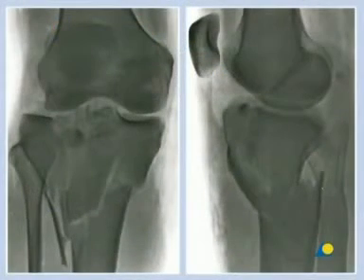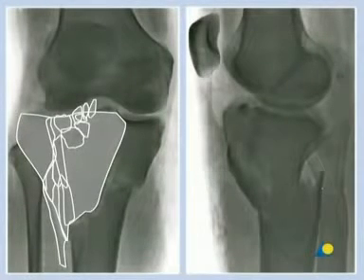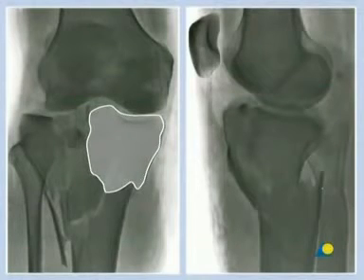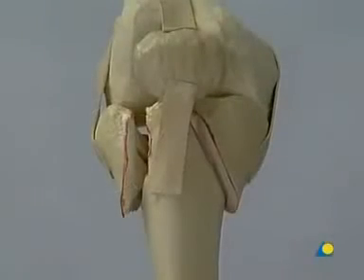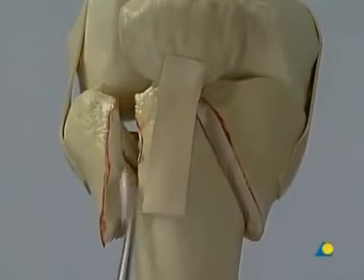Bicondylar type C fractures of the tibial plateau are multifragmentary articular fractures, characterized by the involvement of both the medial and lateral plateaus. As a rule, on the lateral side there is usually considerable comminution and impaction of the articular surface. On the medial side, there is usually a large bone block that has been avulsed or sheared off in one piece. The model shows a large bone block medially and considerable comminution laterally.